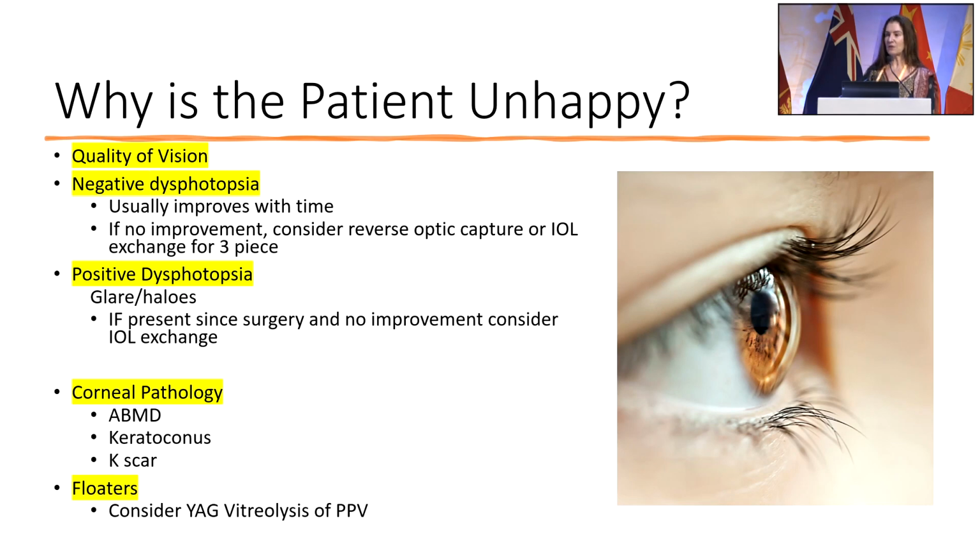If it's a negative dysphotopsia that they're describing, most of the time this improves with time. And I reassure the patient that over 90% of patients who are experiencing negative dysphotopsia, by the time they're 6 to 12 months out, are not going to notice it anymore. So there I just really give a tincture of time. If they are still unhappy a year later, then you can decide to do a reverse optic capture or even an IOL exchange for a 3-piece silicone lens. If it's a positive dysphotopsia, glare or halos, present since the surgery with no improvement, then an IOL exchange may be your best bet.